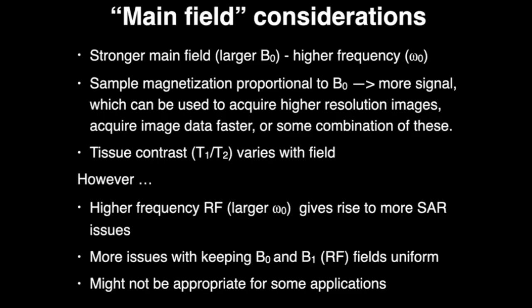And I think the final thing to keep in mind here is that you may not always want to have a bigger magnet, a stronger field. The Cardiac Institute recently spent a lot of energy and a lot of resources trying to develop a lower field system for the work that they were doing and supporting, with some really cool applications and results. So not everything is solved by going to higher fields, bigger magnets, stronger magnets. It really is worth thinking about your problem and how you answer your questions.